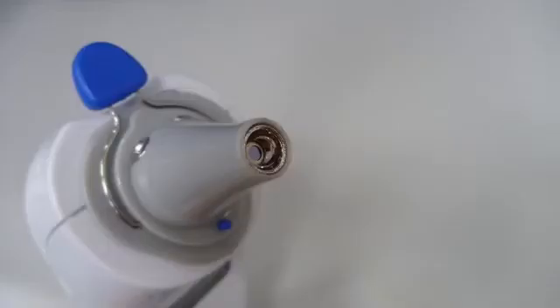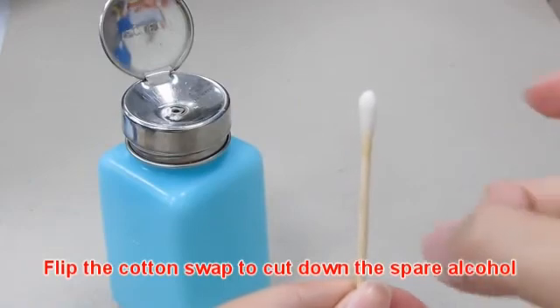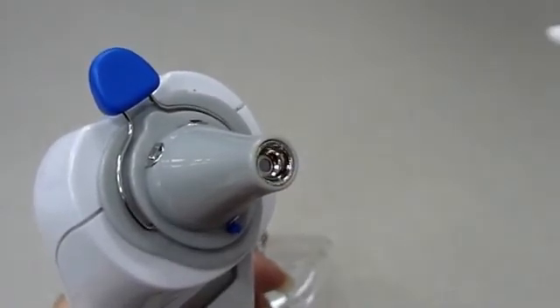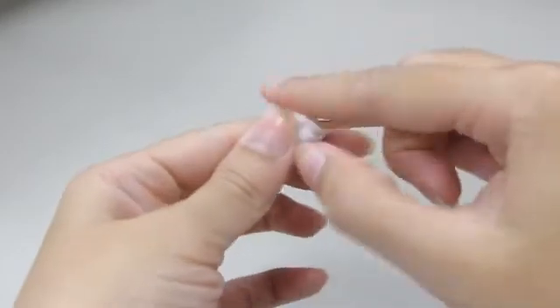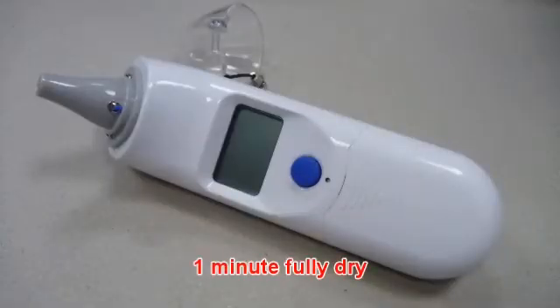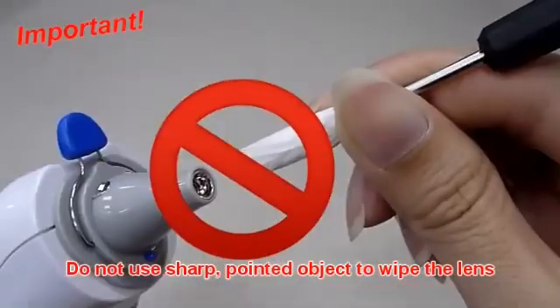If the device is accidentally used without a probe cover, clean the probe and probe lens after each use. Slightly flip the cotton swab to cut down the spare alcohol. If there is no 70% alcohol, use an alcohol prep pad to soak the cotton swab. Allow the probe to fully dry for at least 1 minute. Do not use a sharp pointed object to wipe the lens.